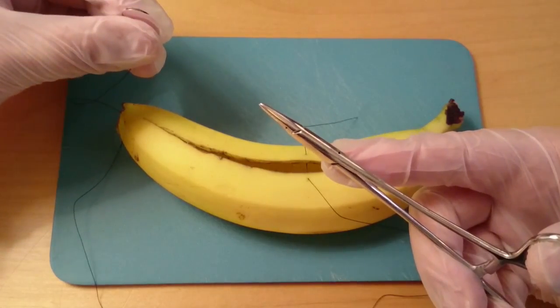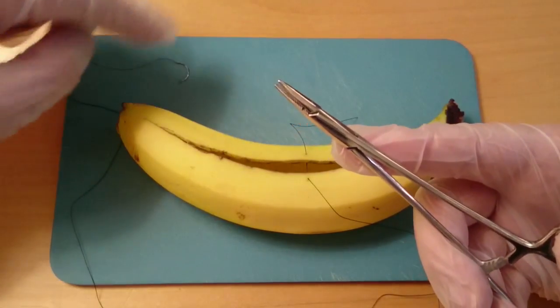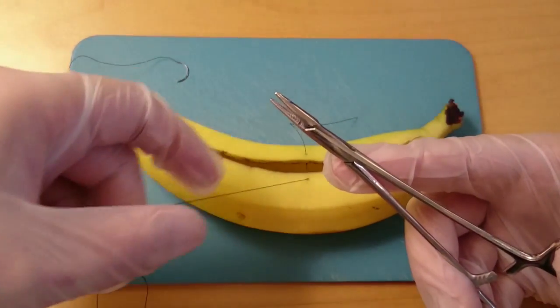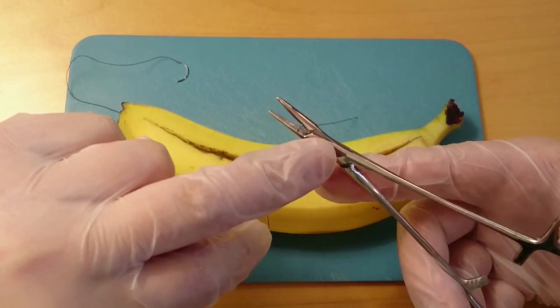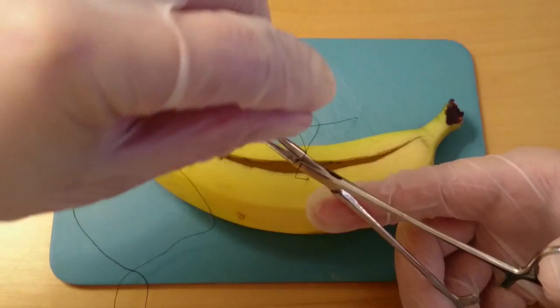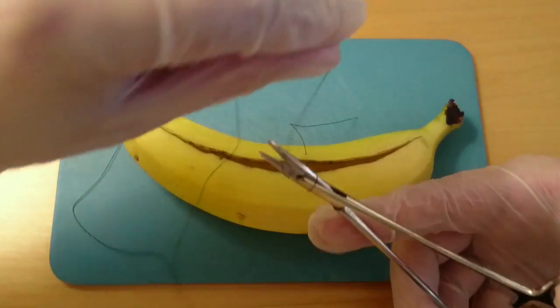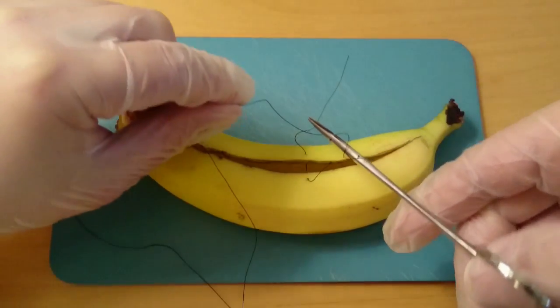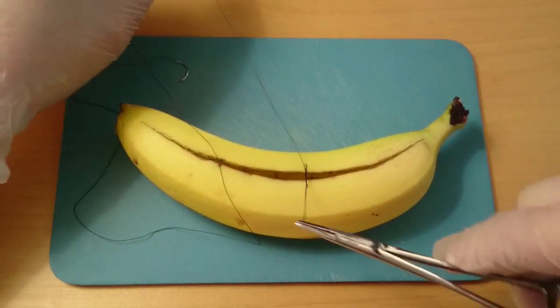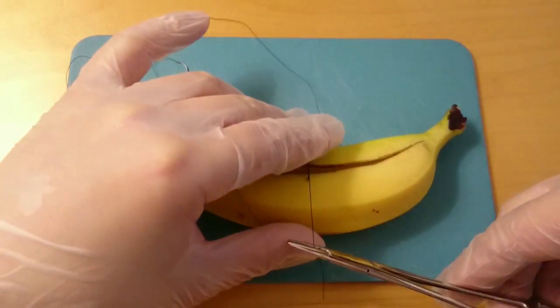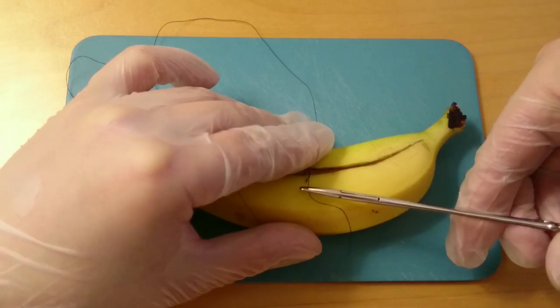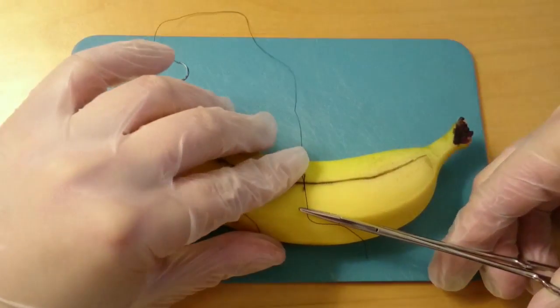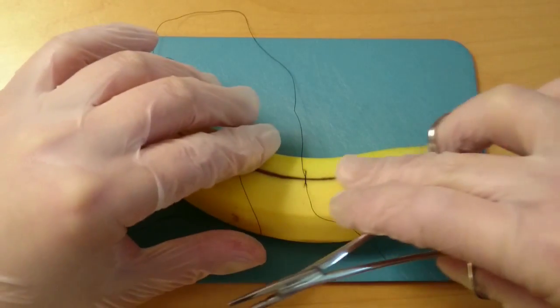Now we're going to do our first knot. You always start with the suture needle on, and then the driver uses the side facing you. Start one way, and you do two loops - just one, two. You take over and pick up the thread and pull it through.